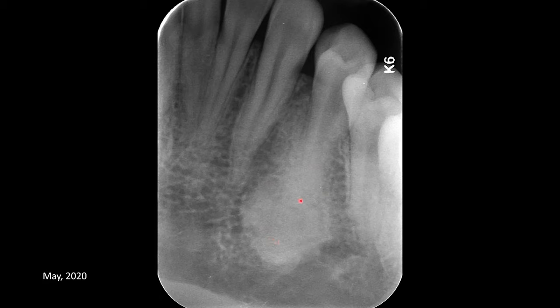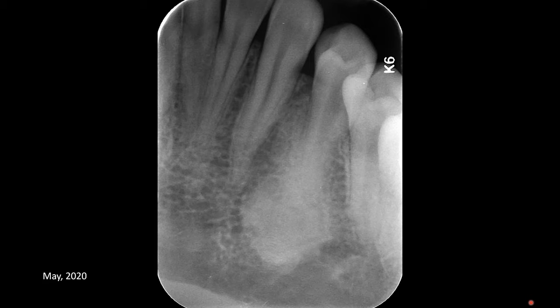The outline of the root is faintly visible. The outline of the radiopacity is distinct and smooth. This mass has homogeneous or uniform density. The tooth is not carious, there is no restoration, and no history of trauma. The patient is asymptomatic. This was an incidental finding on a panoramic radiograph, which prompted the doctor to order this periapical radiograph for better evaluation.